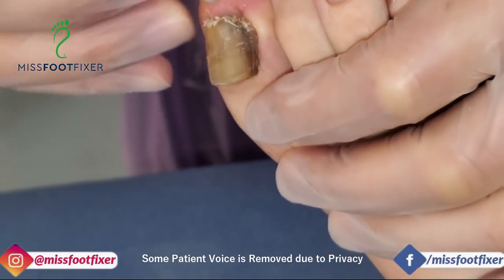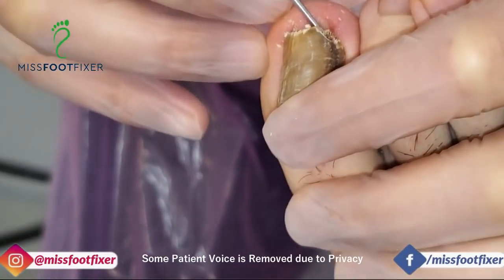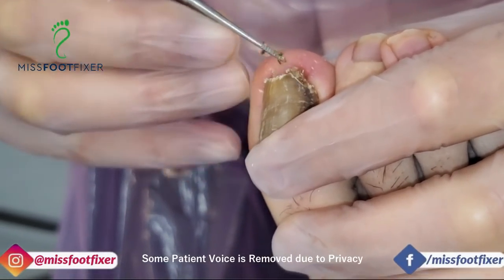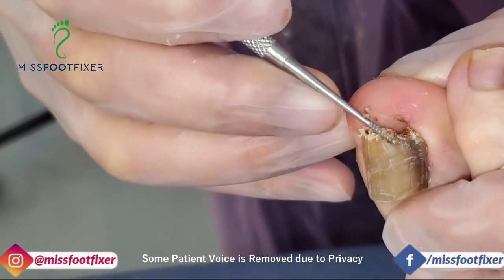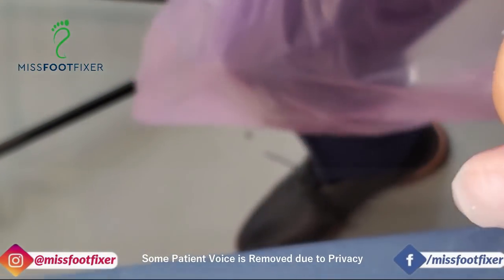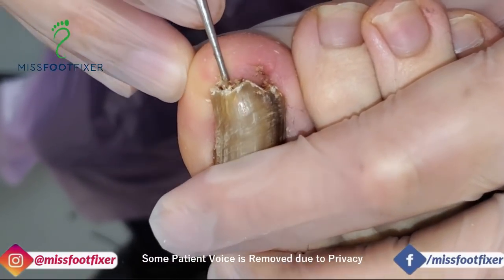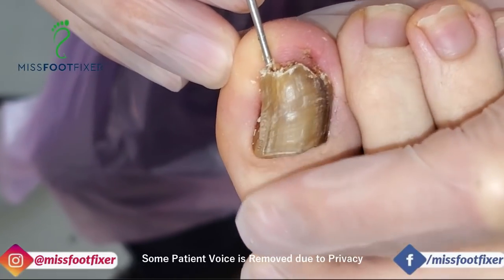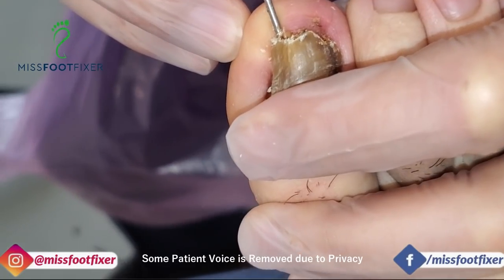No, nothing is attached. Down here is attached. The only bit that's attached is really just where Dr. Kenny just had a... Right, there's all this gunk underneath that we're trying to get rid of here. That's the ingrown bit. That's where it curves. So look, this is what I'm trying to cut out. That needs to go because I think that's the thing that's causing a lot of pain.